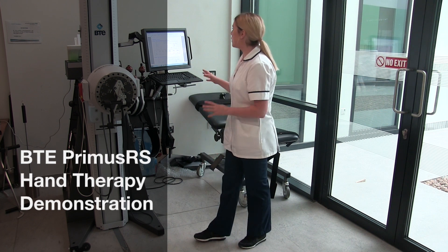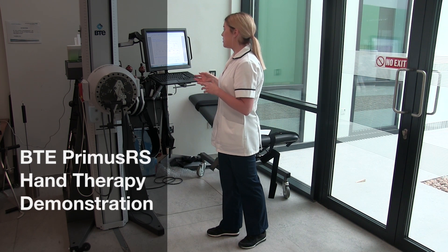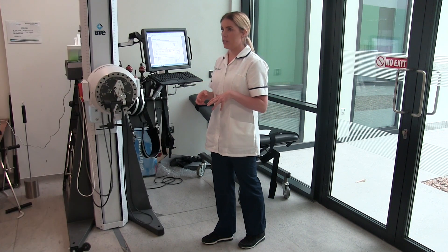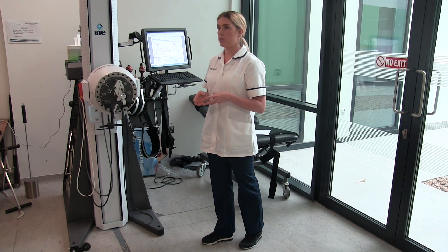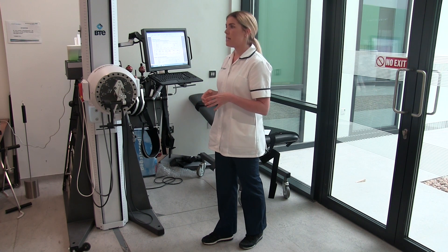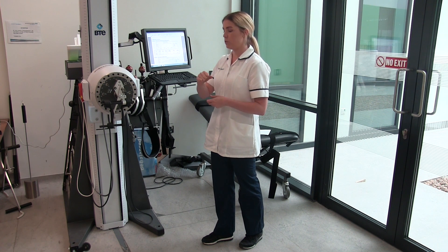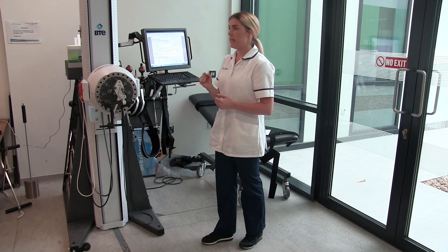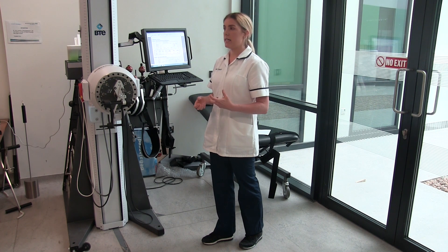The patient I'm going to show you the progress of her treatment so far is a lady who had a shoulder dislocation, which then led to subsequent damage of the radial nerve. This meant in everyday terms that she wasn't able to extend the wrist, fingers and thumb actively, which led to her having lots of problems with gripping and doing daily activities.